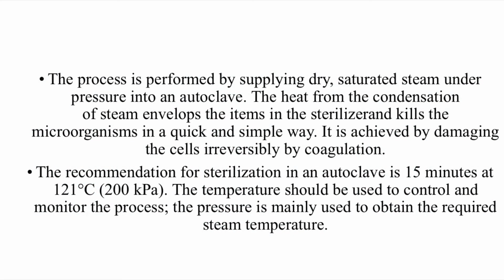The process is performed by supplying dry saturated steam under pressure into the autoclave. Heat from the condensation of the steam envelops the items in the sterilizer and kills the microorganisms in a quick and simple way. It is achieved by damaging the cell irreversibly through coagulation.